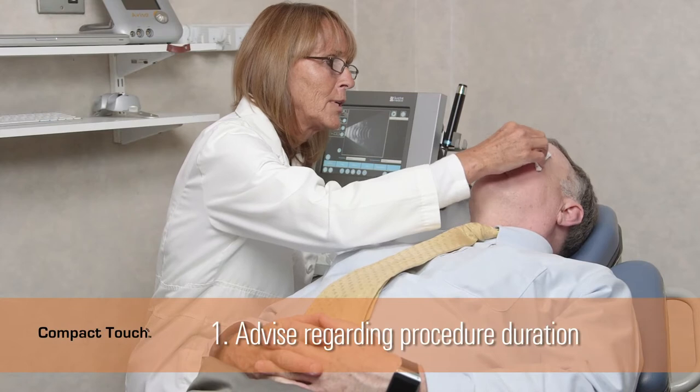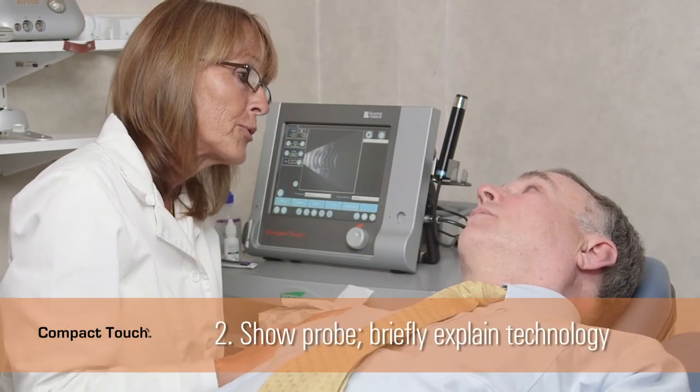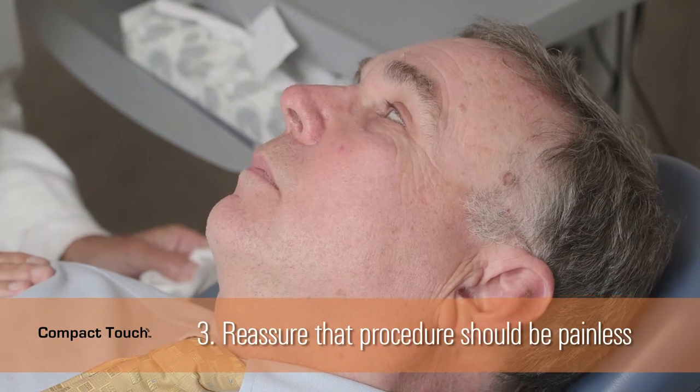It is important to ensure that the patient is comfortable, calm, and cooperative in order to give them a safe and positive experience and to perform a good exam. To this end, it is helpful to review the procedure with the patient before beginning. Introduce yourself and tell the patient how long the procedure is expected to take. Show them the equipment. Explain that you will be using a probe that emits ultrasound waves, and that they should not feel any pain or discomfort during the procedure.